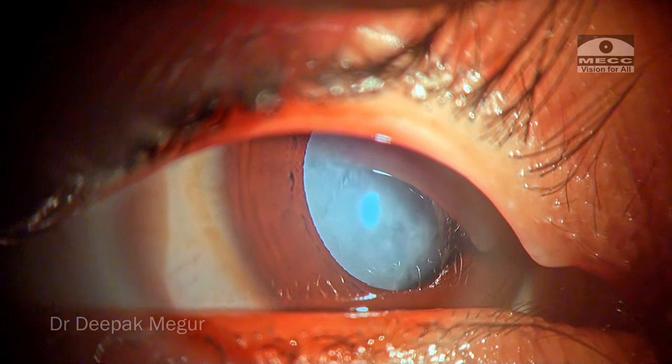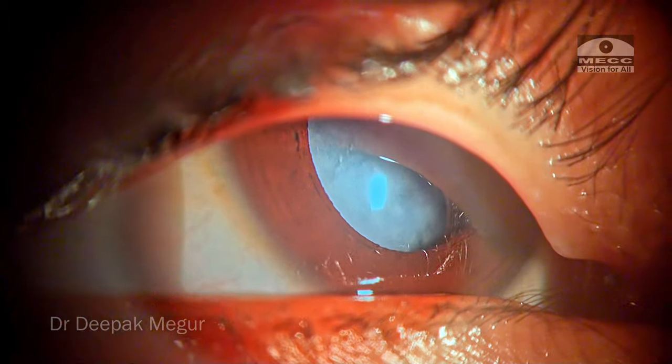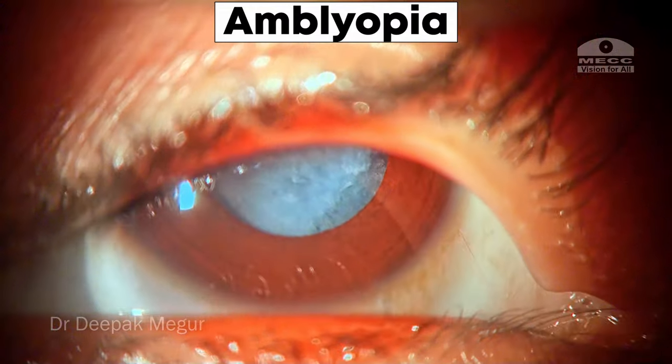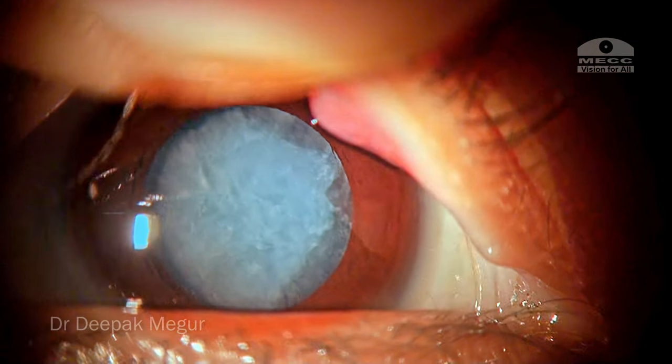Hi, this is Dr. Deepak Meghura and we have a very unfortunate case today. She is a 6-year-old girl and she has got bilateral, extremely dense cataracts.